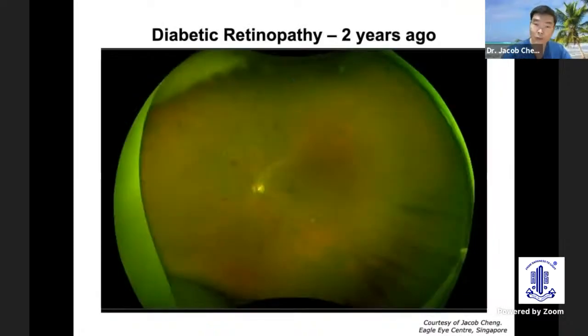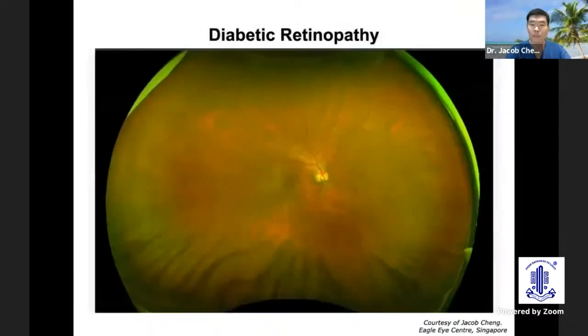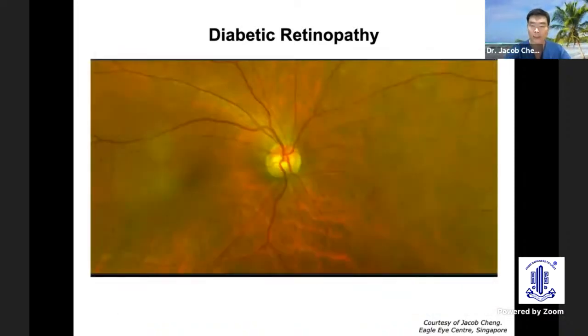When we look back at the photograph 2 years ago, again, patient has more florid retinopathy signs. You can see the dot blot hemorrhages in the four quadrants as well as the cotton wool spots. So does it mean that the patient actually has better resolution of retinopathy despite sugar level being elevated? Patient came back because of symptomatic vitreous detachment. Again, this is what she presented with. But if we go back to the photograph done this time round, we can actually see on the nasal aspect a front of new vessels, despite the almost resolution of the peripheral retinopathy lesions.